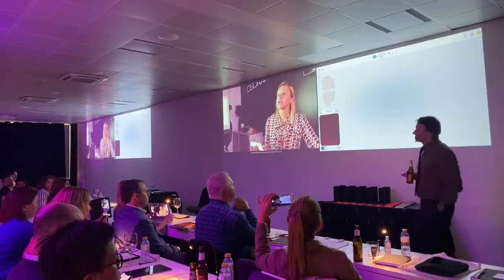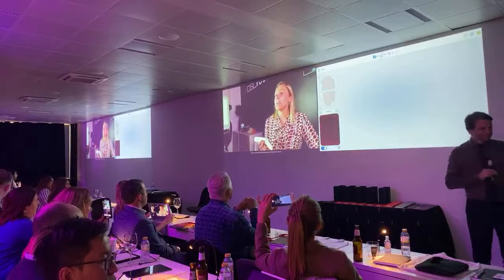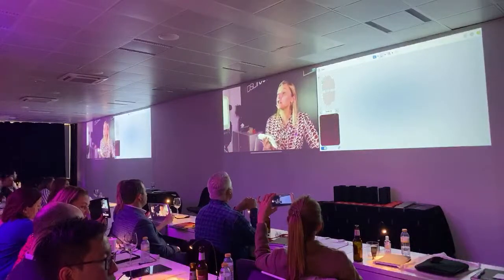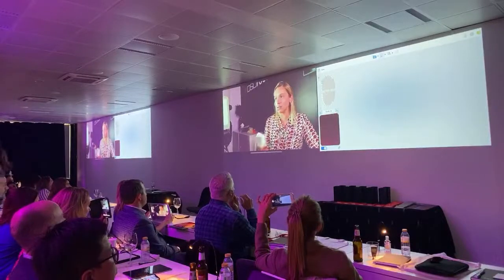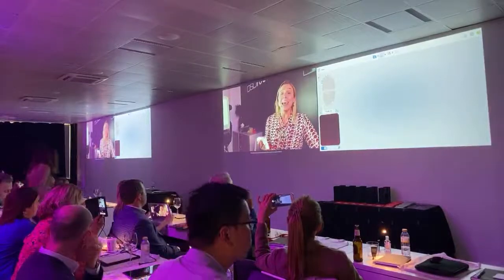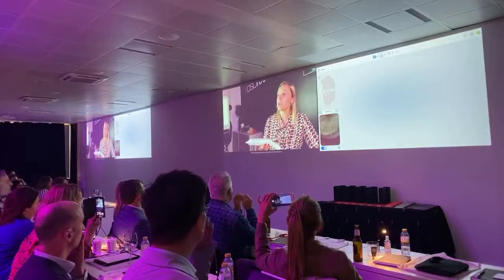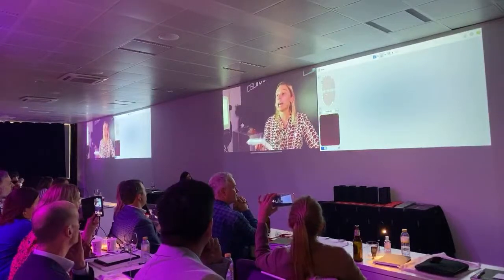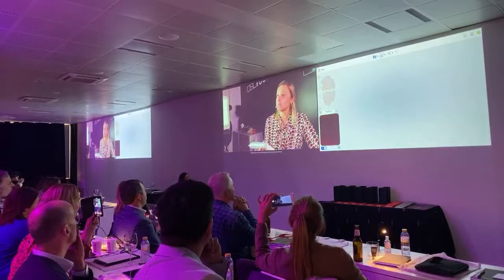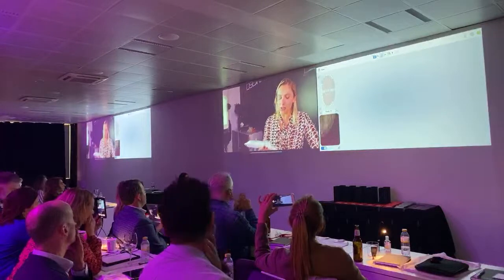Okay? So when I did that first scan of the full arch, my patient had the 2 cords installed before. I have the first one that will remain until I finalize all the scanning, and the second cord is there until I'm done scanning the arch. Now that I'm going to scan the preps, that is the time that I will remove the second cord, okay? And you're already saving time because you're scanning and the cord is doing its function. That is to separate the gingiva from your final finishing line.